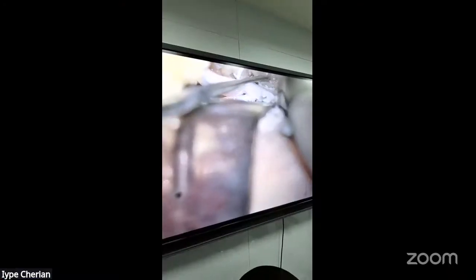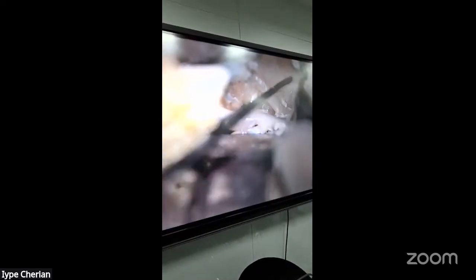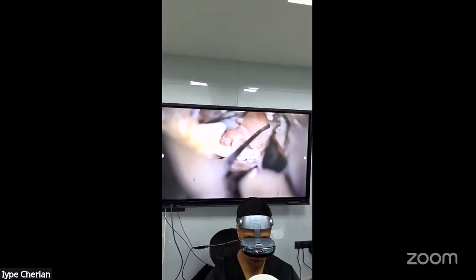Well, you know what? When you see the screen on the wall, that is a great shot, and also to have a neurosurgeon point it out on the opposite wall. Go to the microscope. You know what I mean? Go central. When you're on the screen on the wall, pointing with the finger, you are doing it from the front.